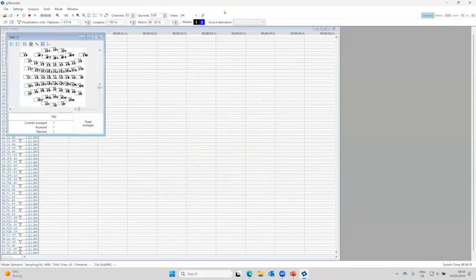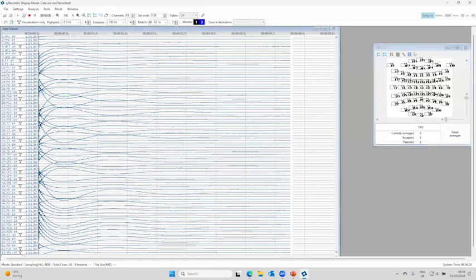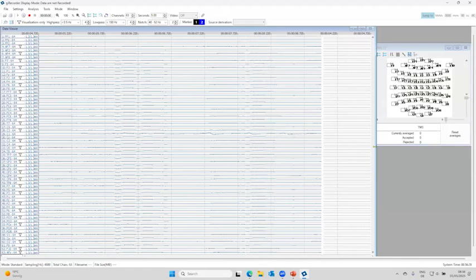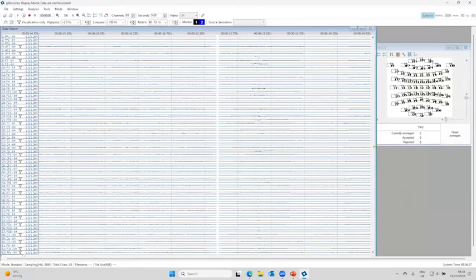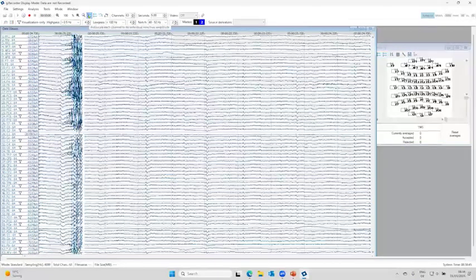The subject should be relaxed, seated comfortably, without any muscle contraction. That is valid for legs and arms, but since Christoph is very experienced, there is no need for special instruction. You would need to do this with a normal, usual subject.